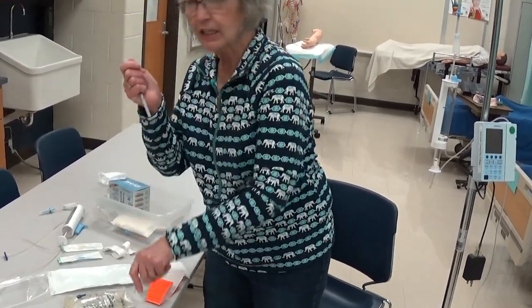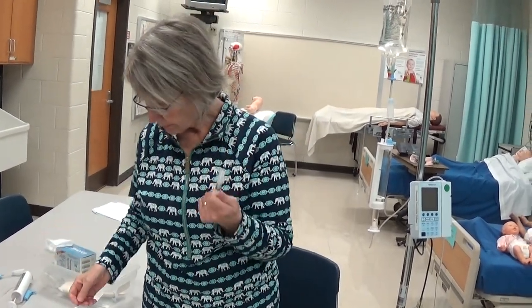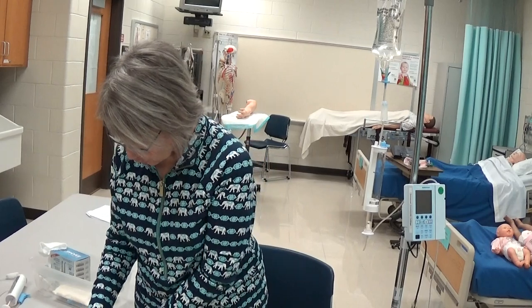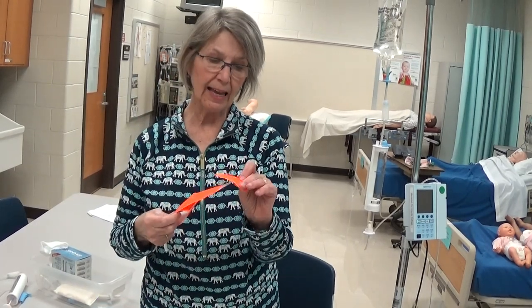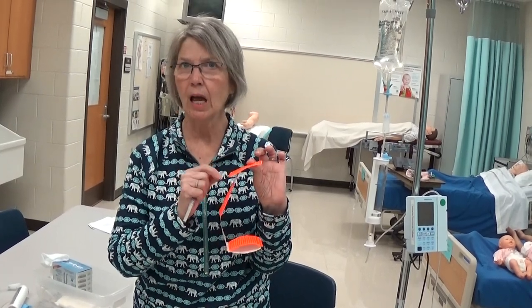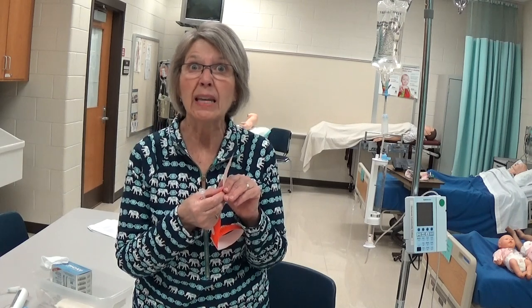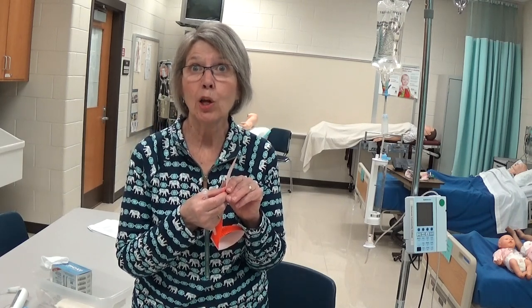You draw up your medicine in a syringe, whatever volume it's going to be. And just temporarily fill out a medicine label — don't worry about filling out every single line because it's only going to be on there for about 30 minutes while the medicine goes in.